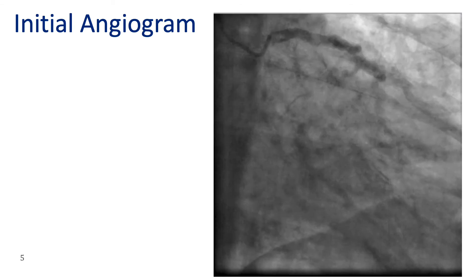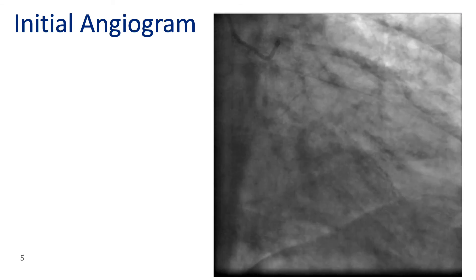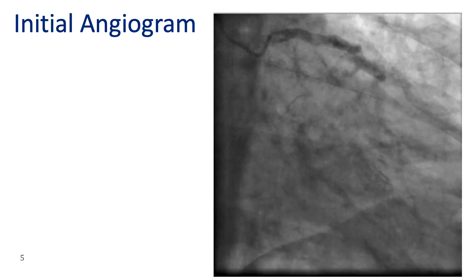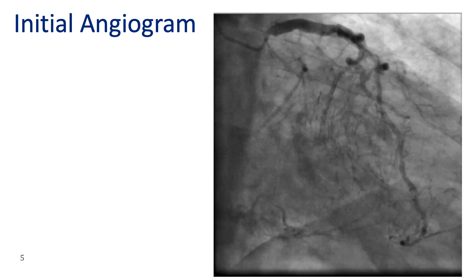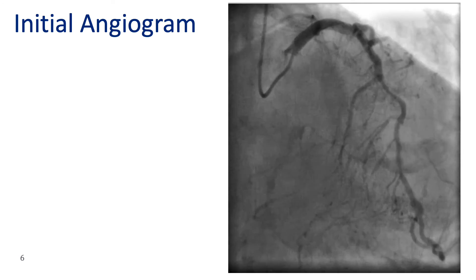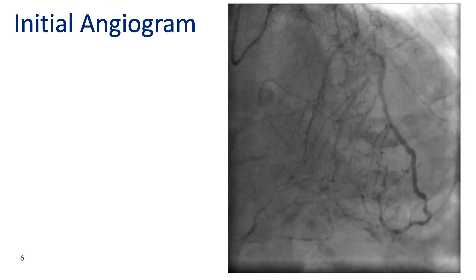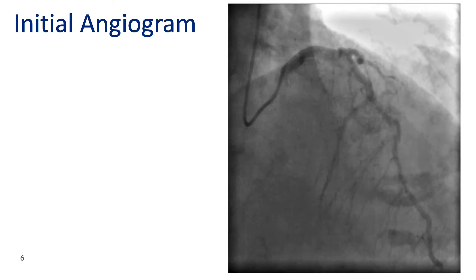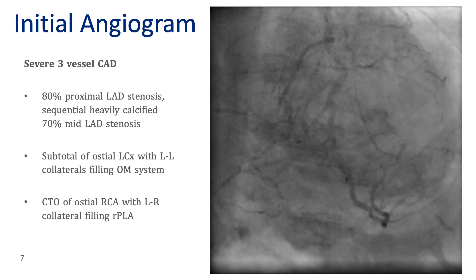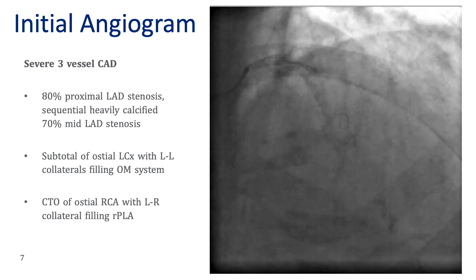Here in the RAO Caudal view, you can appreciate a subtotal occlusion at the ostial left circumflex with left-to-left collaterals filling an OM. You can also appreciate left-to-right collaterals filling an RPLA system with the right being CTO'd proximally. In the RAO Cranial view, you can better appreciate the sequential heavily calcified proximal and mid-LAD stenosis, and in the AP Cranial view we can see the sequential heavily calcified 70% to 80% stenosis within the proximal and mid-LAD.